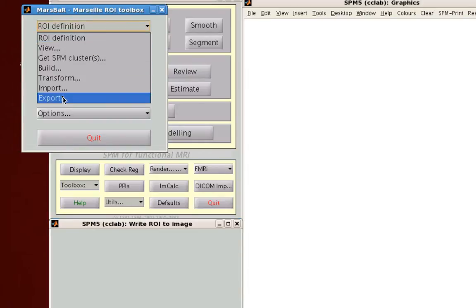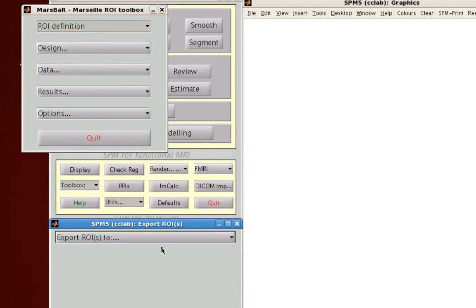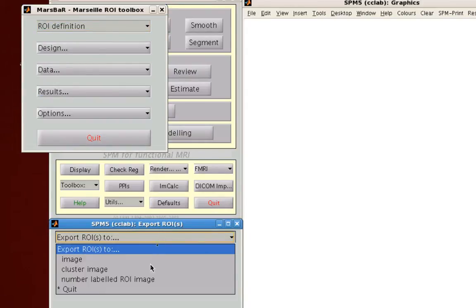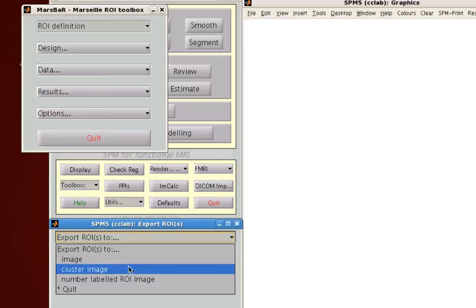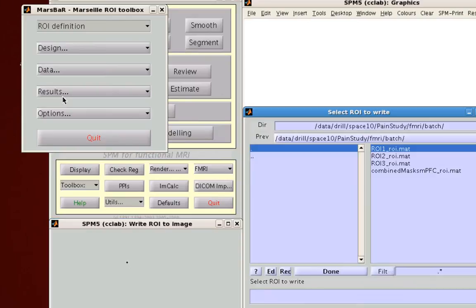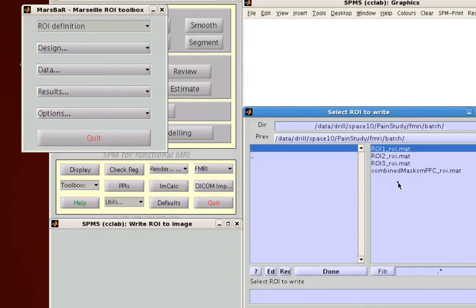Alternatively, you can do the following where you create a number labeled ROI image. So each ROI that went into it is going to have a different number associated with it. For example, R1 is going to have the value of 1, R2 the value of 2, and so on. Either one is fine.